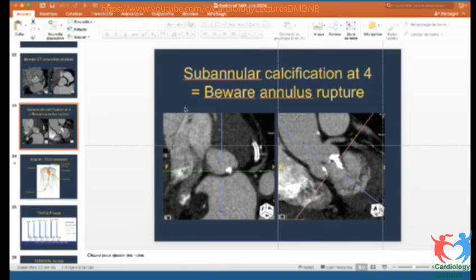If you have a small annulus with the self-expandable, you will have less mismatch than with the balloon expandable. If you have a redo procedure for valve in valve, it would be very simple with the self-expandable valve in your bioprosthesis. If you have very calcified valves, it would be more suitable for Edwards valve. You see, you have a lot of situations, but I think if you have the experience with one valve, you can treat more than 80% of your patients. Okay.